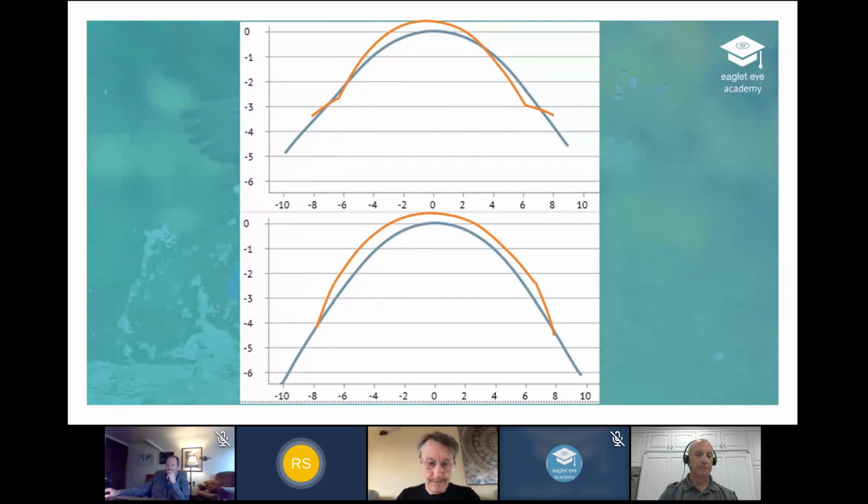And here you see a visualization of what the problem was with the classic Zen lens design. So in the upper image, you see that there was too much push where the lens is landing on the eye. And when you were looking vertical, it was only touching the eye at the very edge of the lens. So I hope that's answering your question. I will move on.